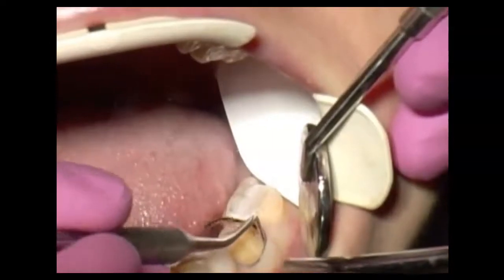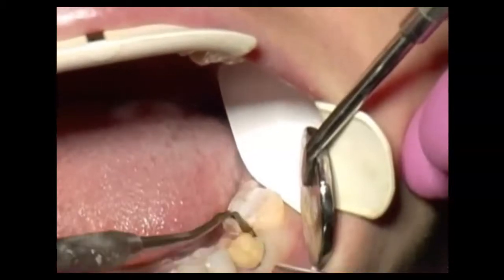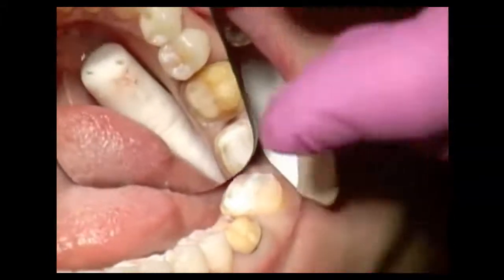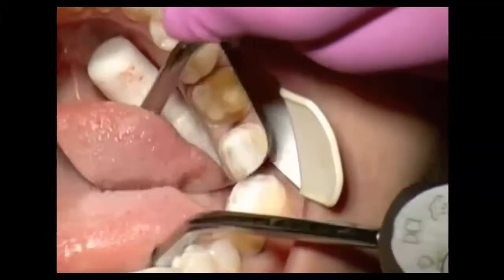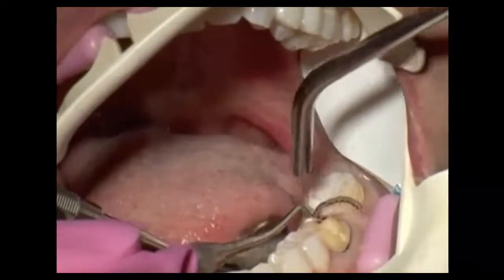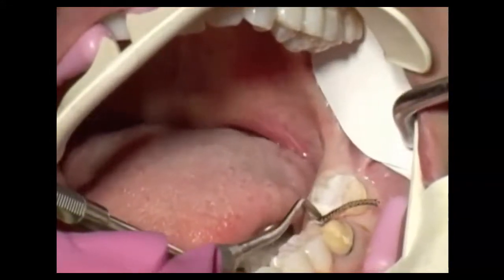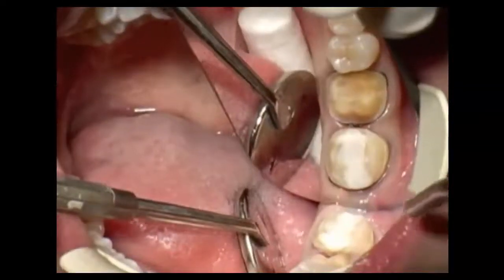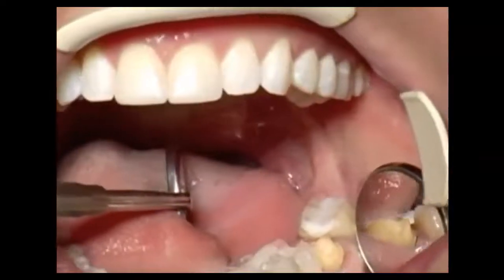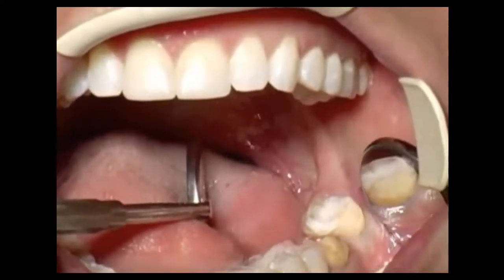Here they are packing cord, and again the purpose of retraction cord is to just temporarily displace that gingiva around the gingival sulcus. Again, we want to ensure that as the material is being put into there, it creates a very accurate impression and captures all of that anatomy that is going to be needed to fabricate a good fitting crown. Retraction cord stays in for 5 to 7 minutes.